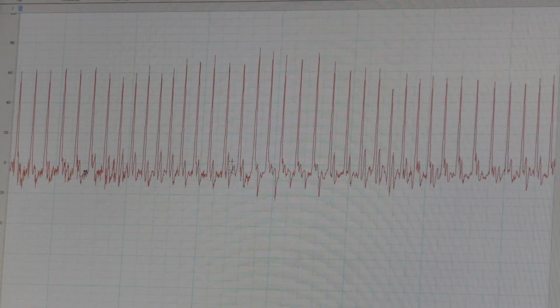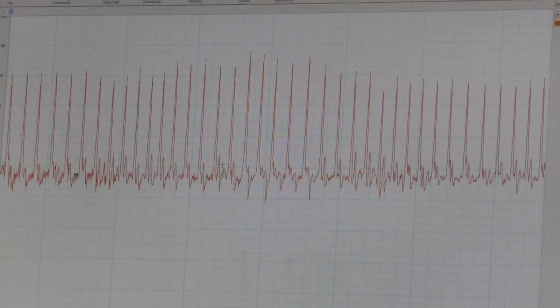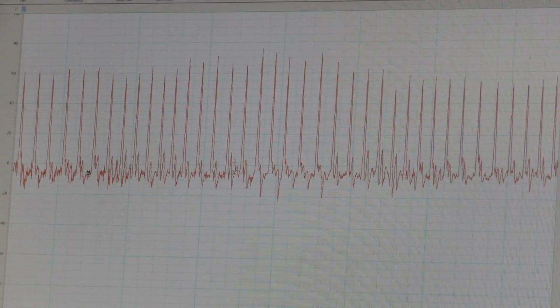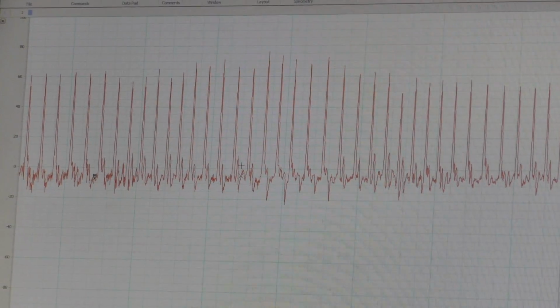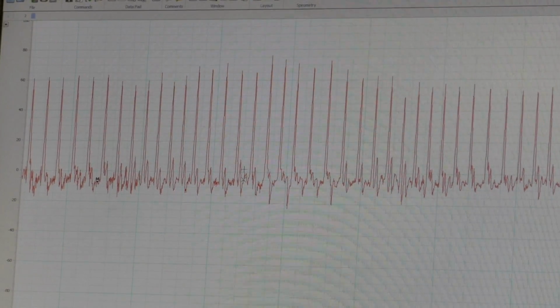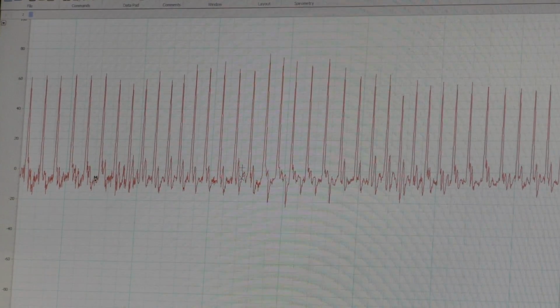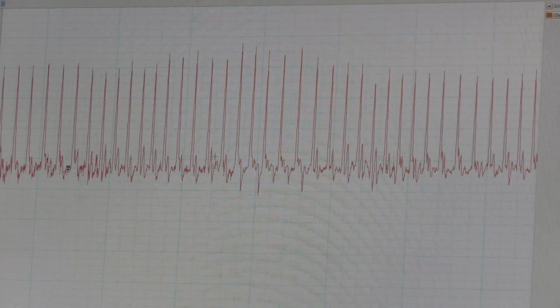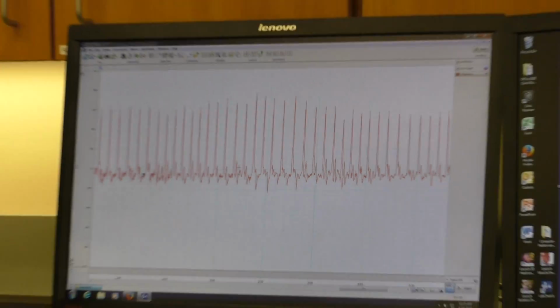So that's a simple measurement of just the change in pressure in my finger. What it gives us on the screen is a representation of what my heart rate is. And this is a nice, easy introduction to PowerLab because we only have one wire to hook up on the front, and we go through the basic setup. So this is what you'll start with in lab this week.